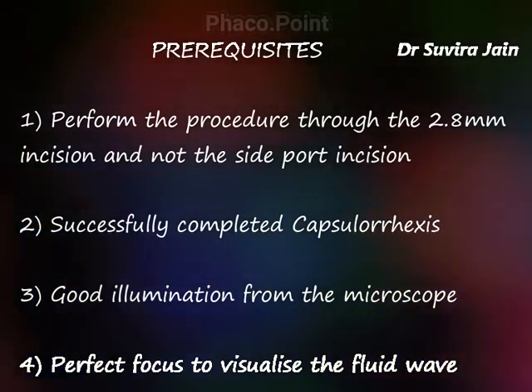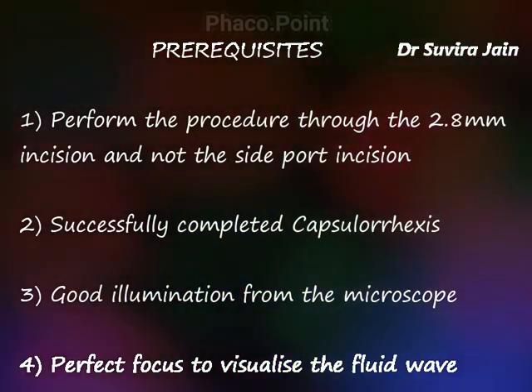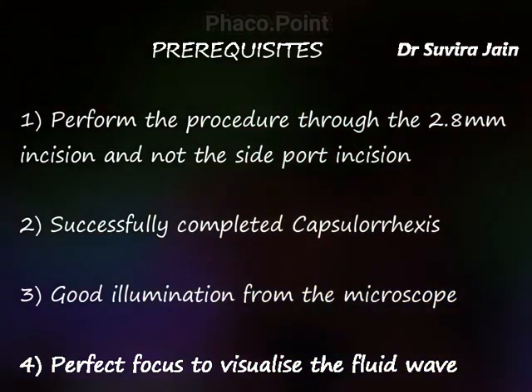The other prerequisites include a complete capsulorhexis, good illumination, and a perfect focus on the capsulorhexis edge to be able to perform a perfect cortical cleavage hydrodissection.